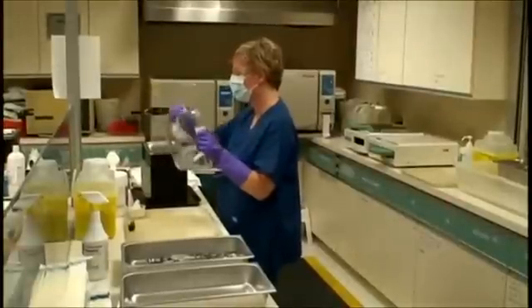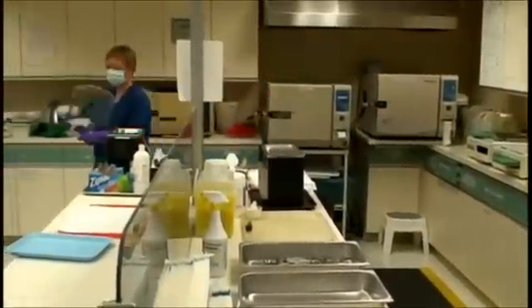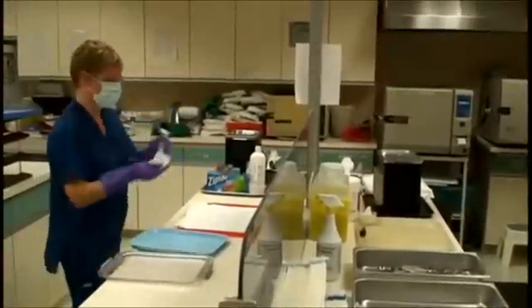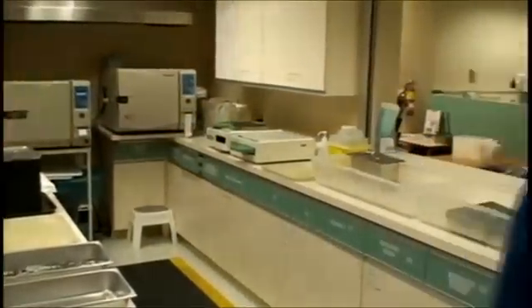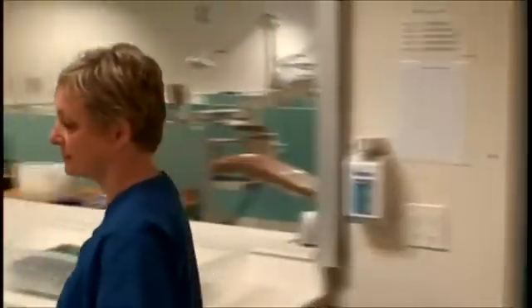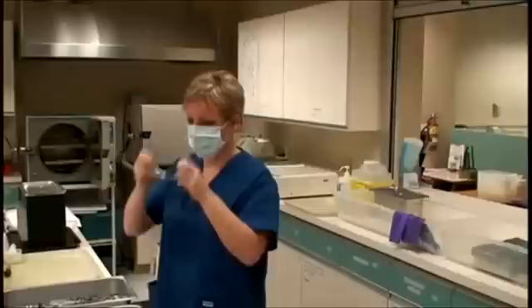Return to the unit to sanitize and set up for the next client. Once the room has been set up, return to the CSR and place PPE on. Remember to sanitize hands before gloving.